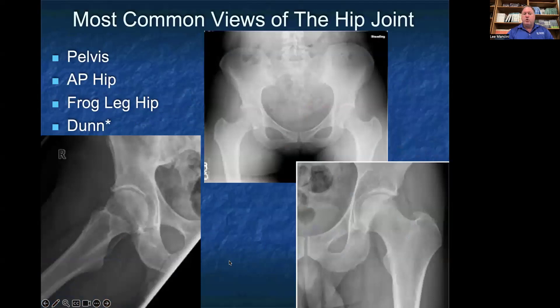The three most common views of the hip joint are typically a pelvis view, which you see here in the middle top, an AP of the hip, which you see in the bottom right, and a frog leg view, which you see in the bottom left. There is also the Dunn view, which we'll be discussing as well.